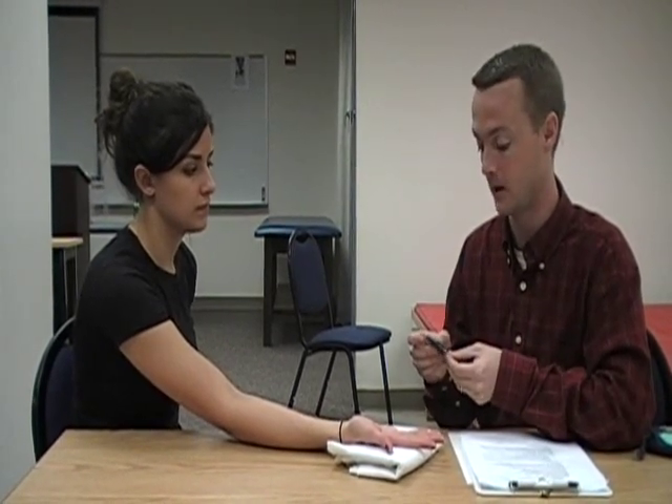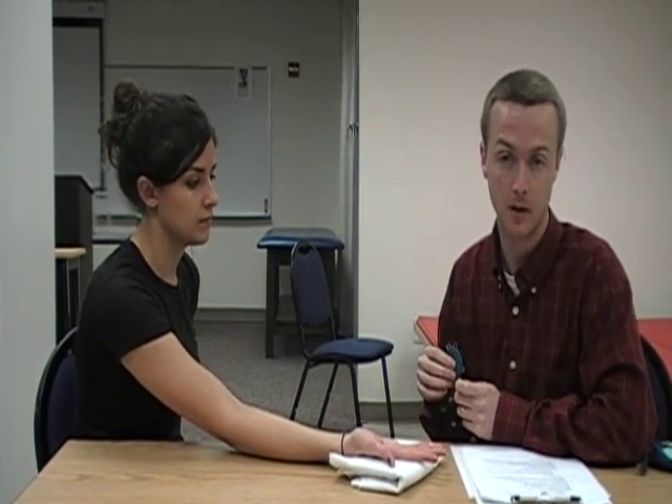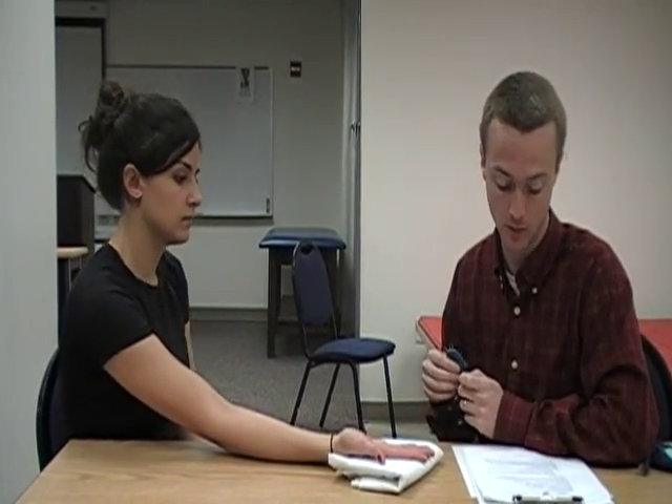We'll begin with the five. As they tell you if they can feel the five millimeters or not — if they can feel the five millimeters, you would have them move to a four, a three, a two, and so forth. We will begin with the five millimeter and I will ask Elizabeth to tell me if she feels one point or two points.